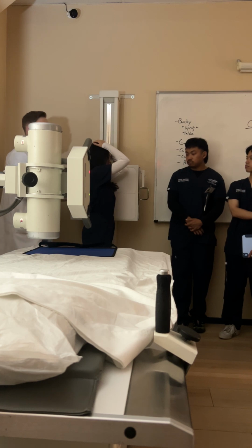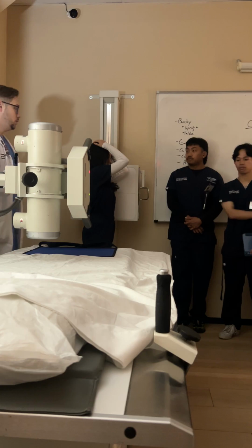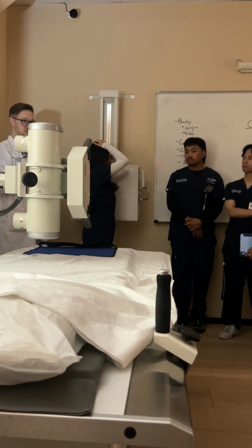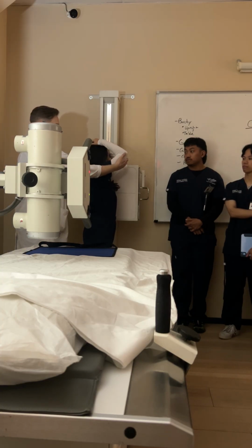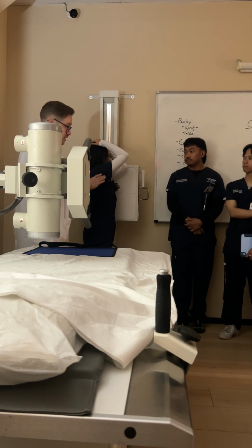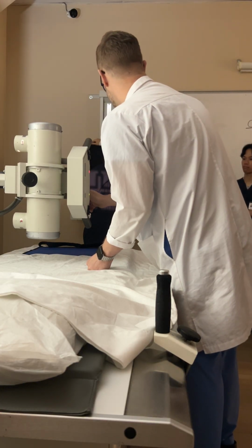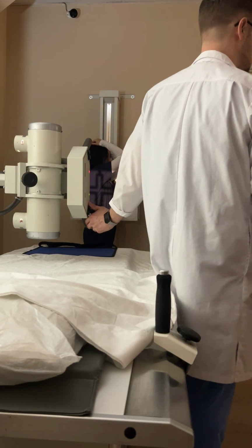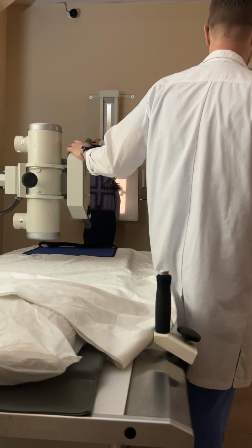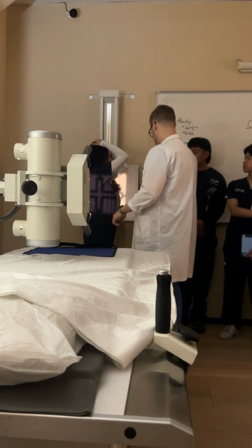There you go. I don't want anybody leaning, because that changes the orientation of their chest. I want them as close to my bucky as possible so that everything is in the same plane. Keep those elbows forward, raise up. Great. I don't want the arm to be over any of the lung field. What is the one change that you make when switching from a PA to a lateral on your CR? Down 1.5 to 2 inches.